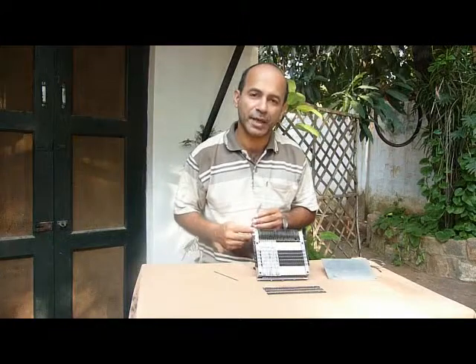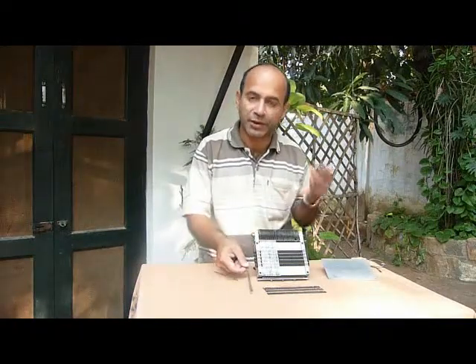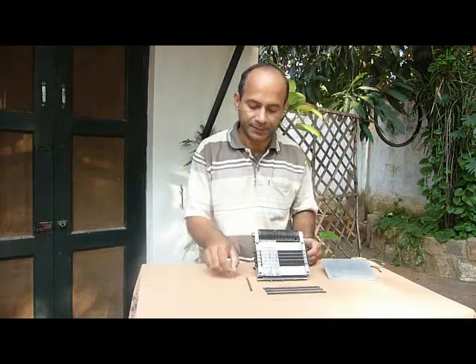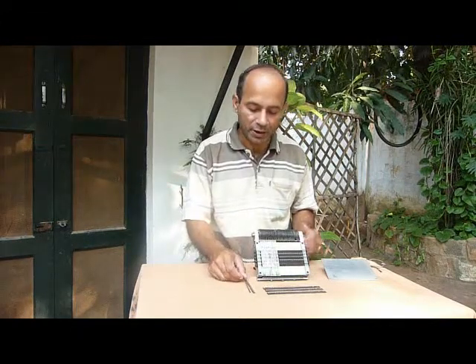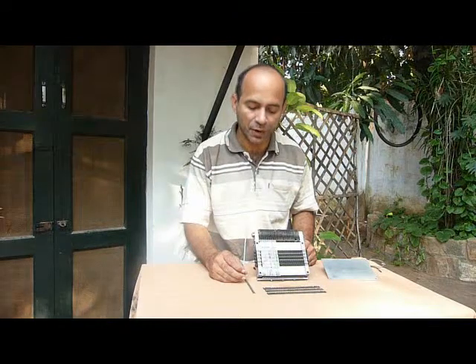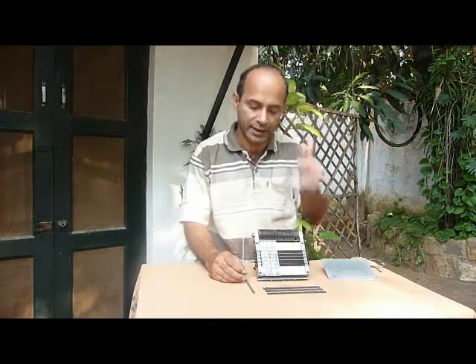and I'm going to try and explain to you how it's done, because based on how it's done, you get to know how you can refresh it and change the information in the different cells, refresh the cells and reset them if necessary. And every column basically consists of a little slide that serves to lock or unlock every pin in that particular column.